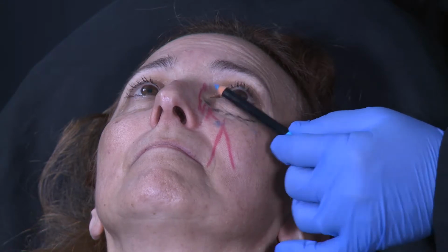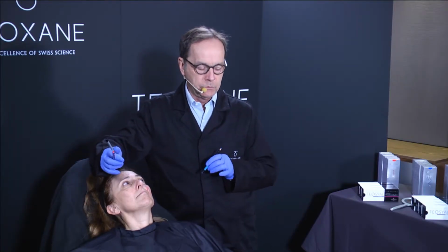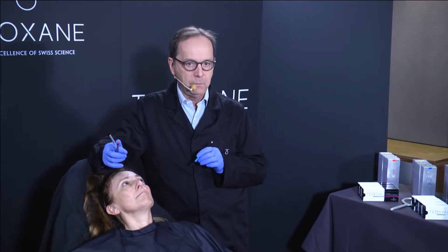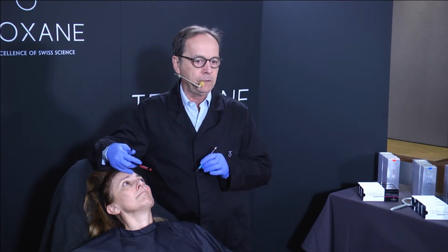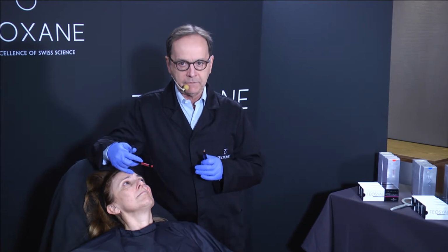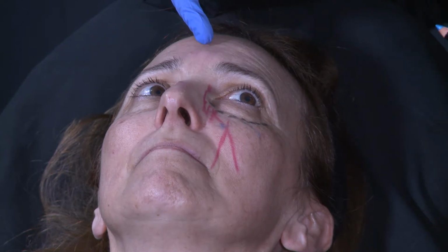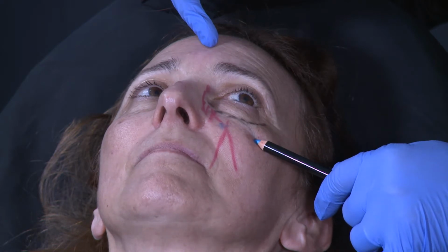You will see that this afternoon. This is my protocol, whatever the injection I do: my patients always come back to my office 3 weeks after, just to check. If you don't see your patients after 3 weeks or 1 month, you will not have the feedback of your injection. Then I do the touch-up. But I tell my patient, when I do my first injection, perhaps you will have a touch-up. This one will not need any touch-up. So I go on with my technique.